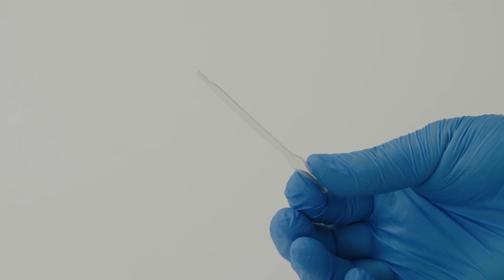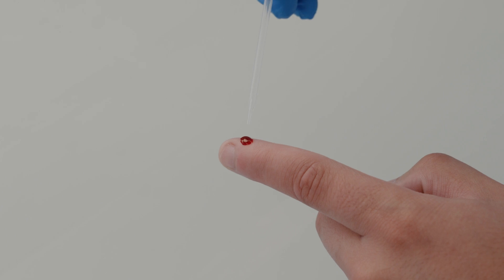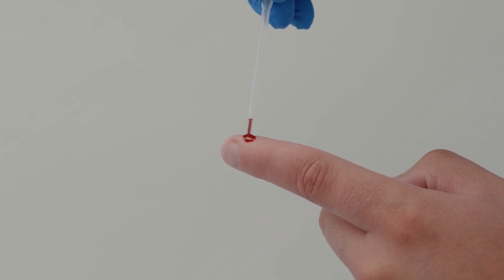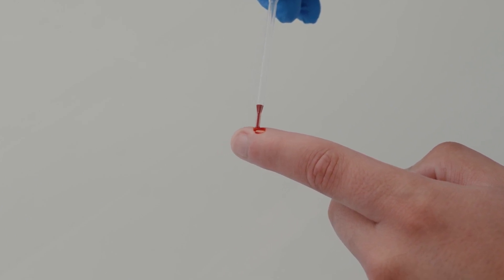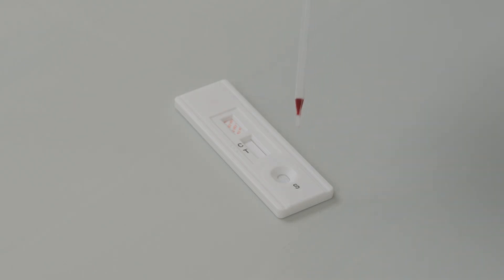Squeeze the pipette bulb tightly to create pressure. Release a small amount of pressure on the bulb to draw up the droplet of blood. Pipette one drop of blood in the sample well, marked S.